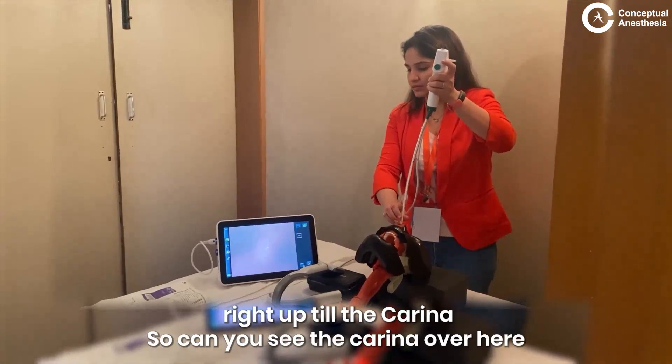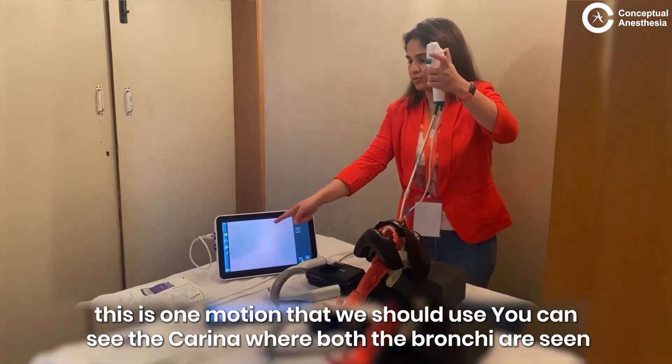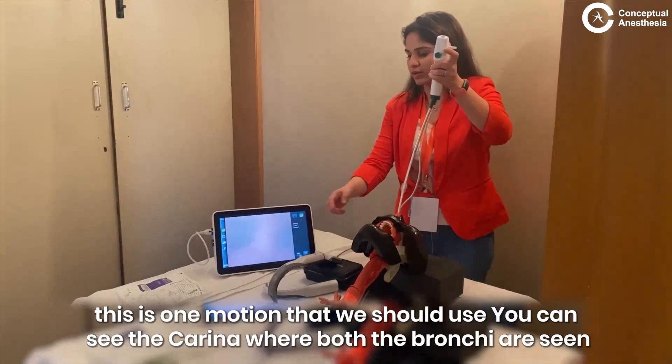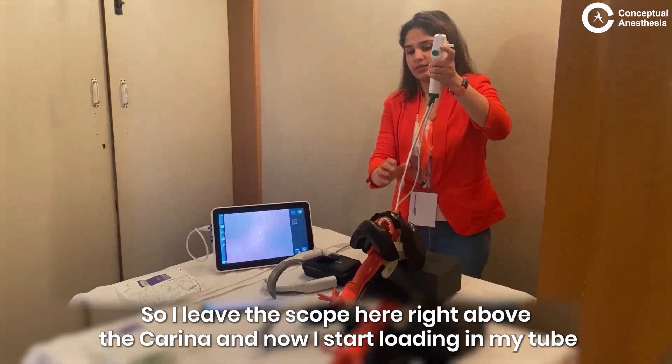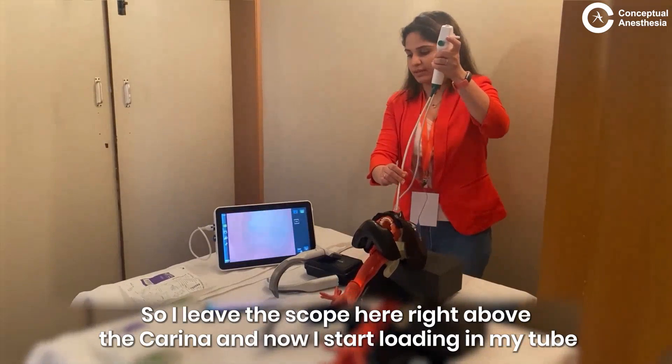Can you see the carina over here? This is one motion that we should use. You can see the carina where both the bronchi are seen.